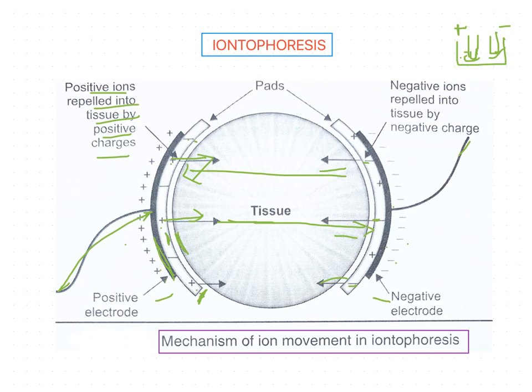The drug that is introduced through the superficial layers of the skin is driven further deeper by the formation of compounds in the bloodstream. Normally the depth is not that satisfactory in iontophoresis. Once the drug mixes with the bloodstream, there may be a chance of it entering into the deeper tissues.